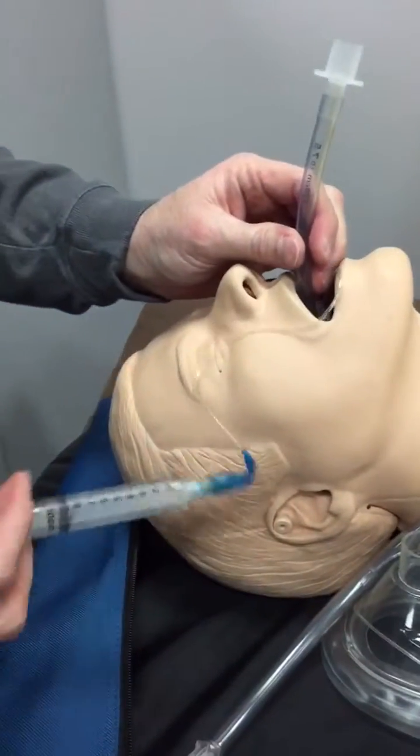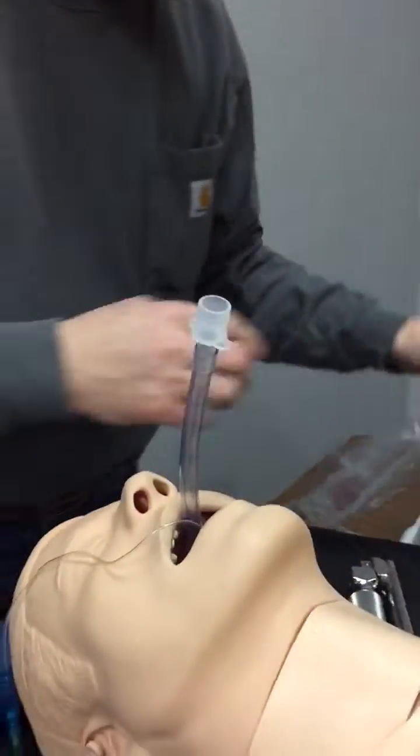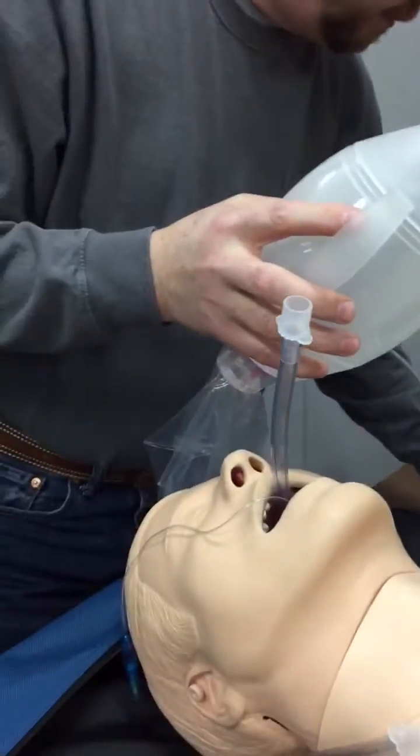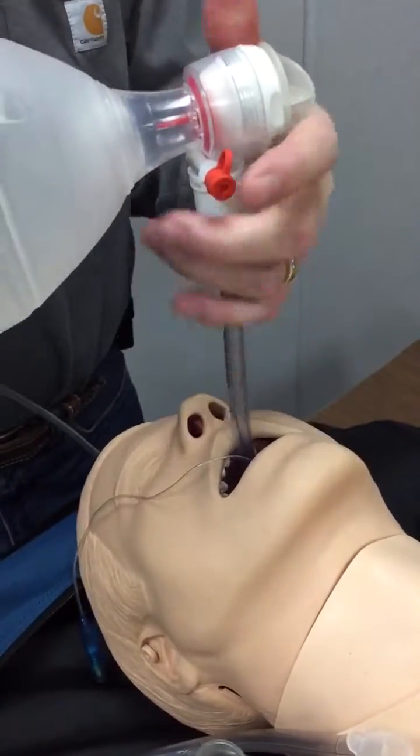We inflate our cuff, remove the syringe, hook up a BVM, and begin to ventilate.